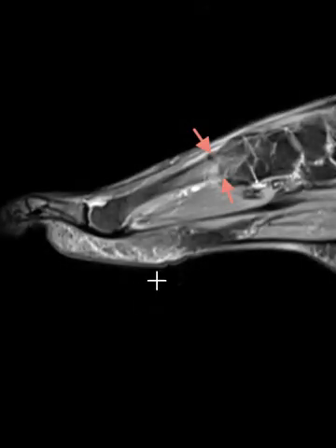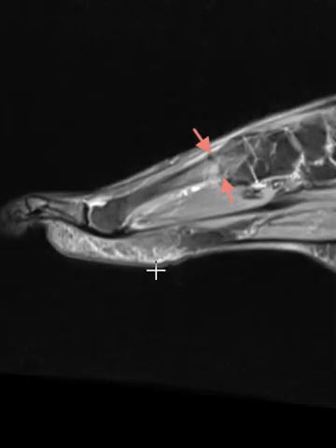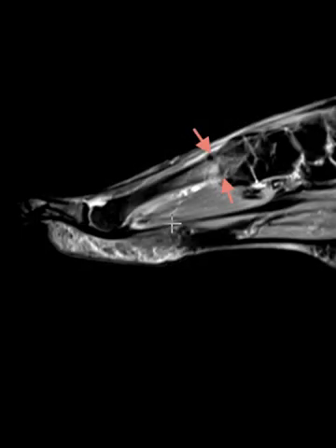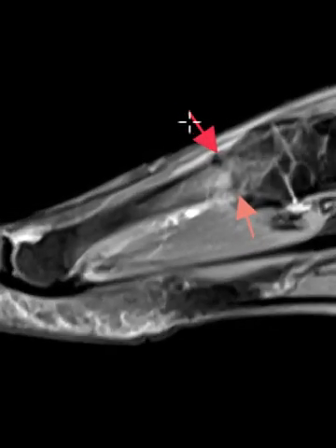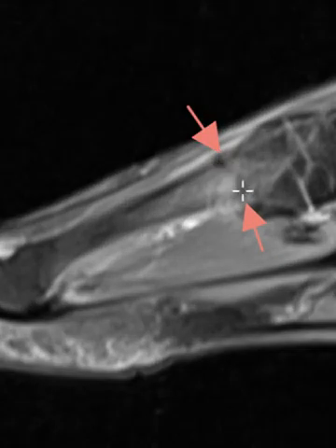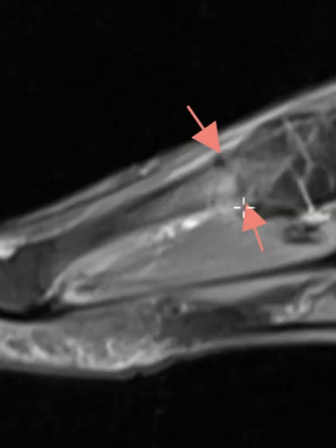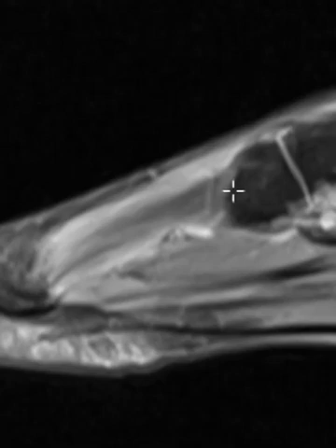This is a sagittal view, looking from the side where we can see a toe here. This is the second metatarsal bone; this is the head by the toe. We see these arrows pointing at this line — this is a stress fracture line. And then the fogginess around it is the marrow edema. So a metatarsal stress fracture.